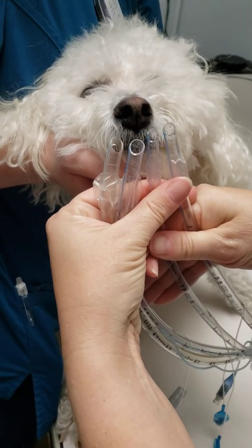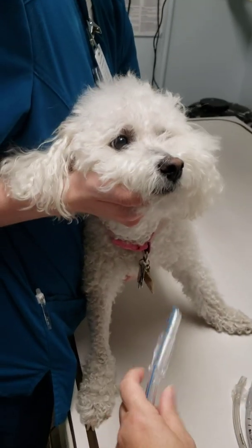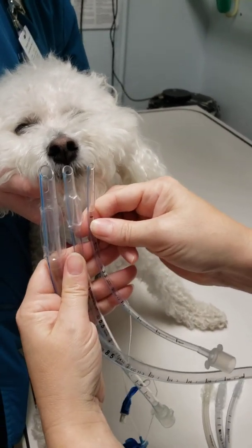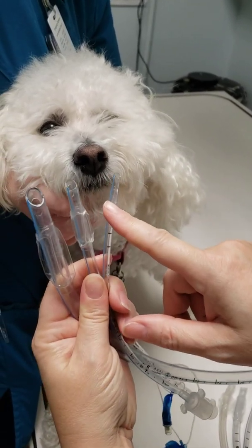The one that looks the closest in size is this tube here. To exaggerate that point, I have a larger tube and a smaller tube. Because what I had before were all very similar in size, but you can see how this one is going to be way too big, and this one's going to be way too small.